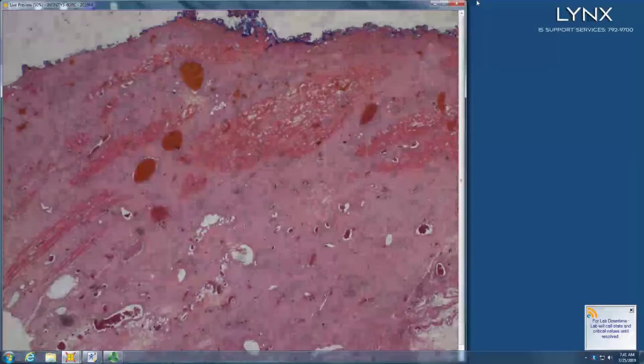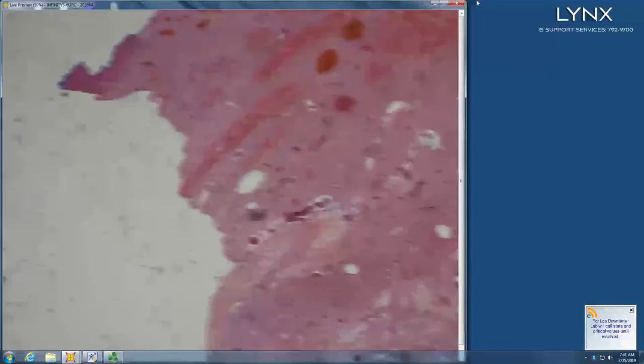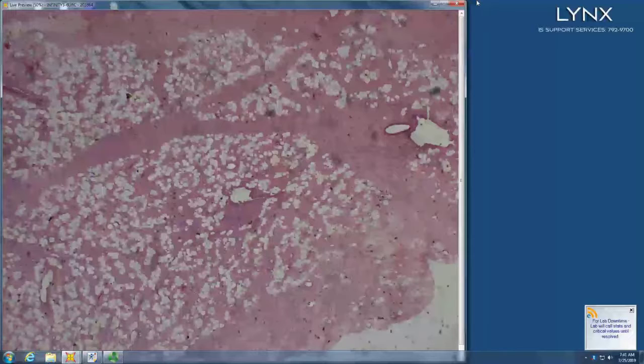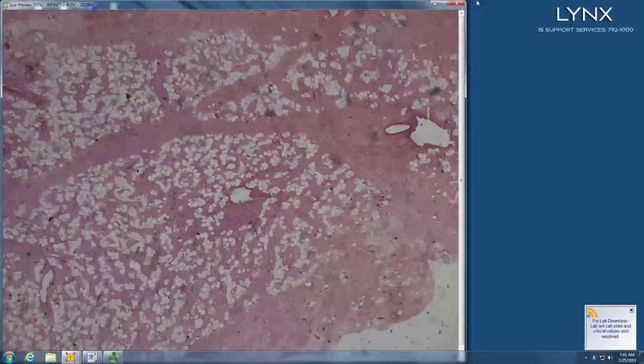So pretty big specimen. All the way down into striated muscle, right? Pushing that muscle apart. So here it almost has like a DFSP, so myxoid DFSP, or diffuse neurofibroma, and this is another NF1 patient. I mean, they really look alike, and it infiltrates into muscle. It really looks like a growth pattern like a DFSP, a very common look-alike.